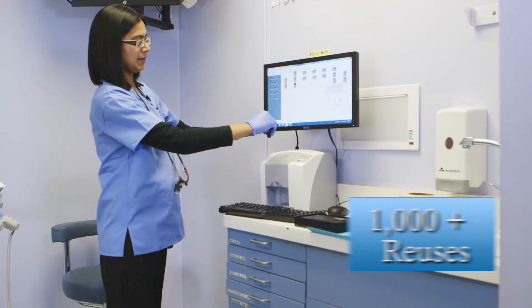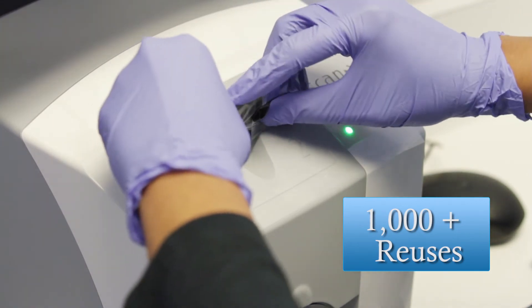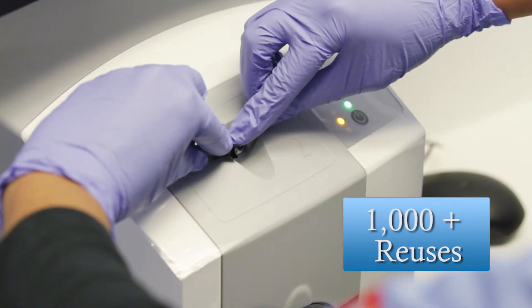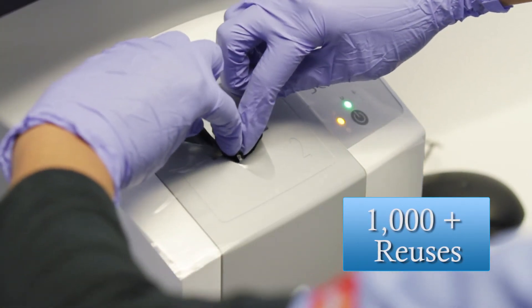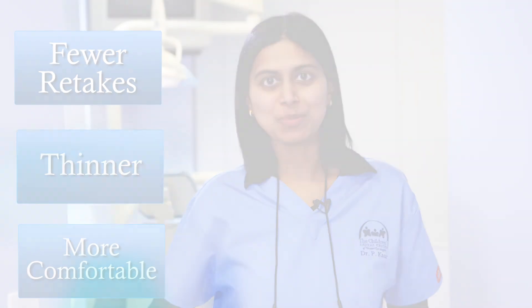One great thing about the sensor is you can use it up to a thousand times or more to capture your images. You can drop it — it won't break, unlike your digital wired sensor. With ScanX Swift, there are fewer retakes because the flexible sensor is thinner and much more comfortable to patients of all age groups.